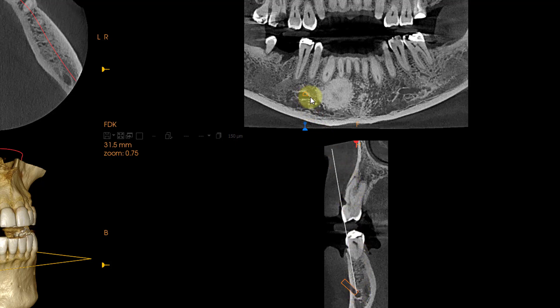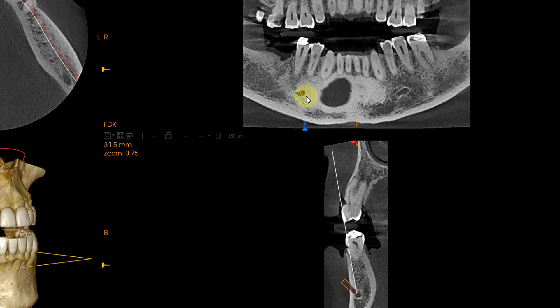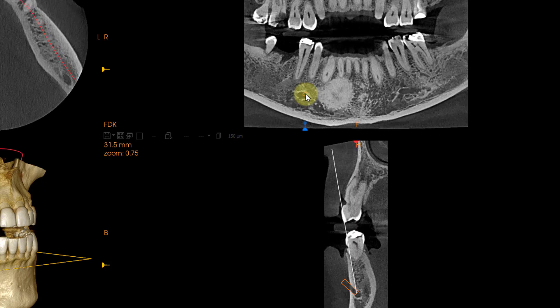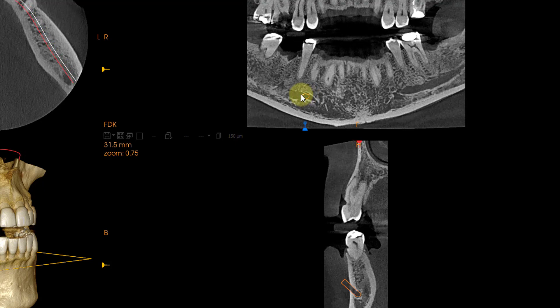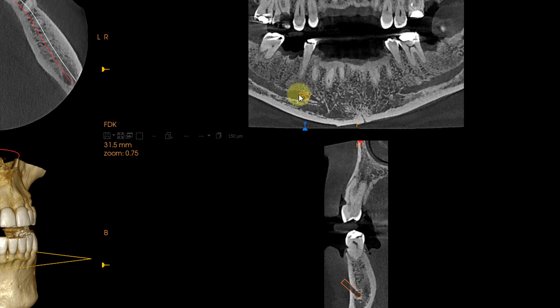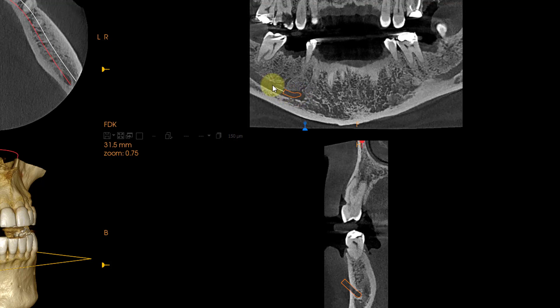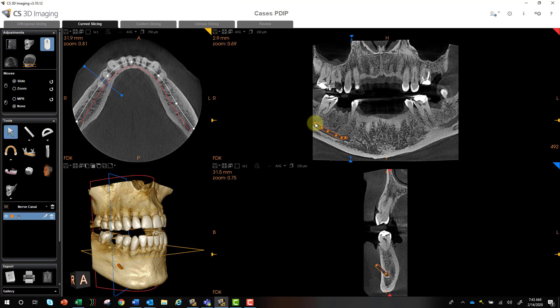Now you can see where I've begun to map the nerve. Using my mouse wheel, I'm scrolling out to the buccal — you can see my foramen — and then scrolling until I get to my next spot on the nerve, doing a single click. I'm scrolling and clicking until I reach the end, then double-click the last one and you're done. So that's one way to do it.